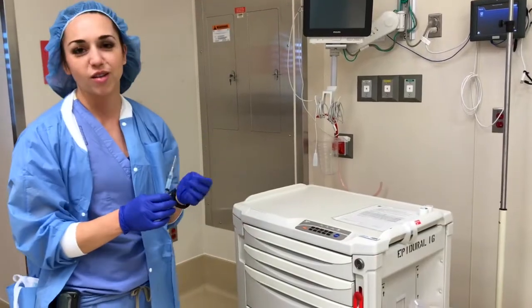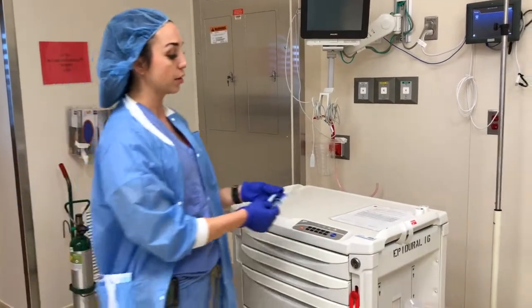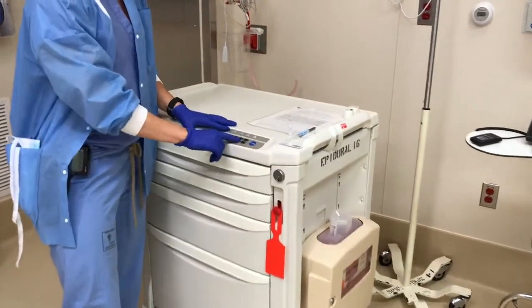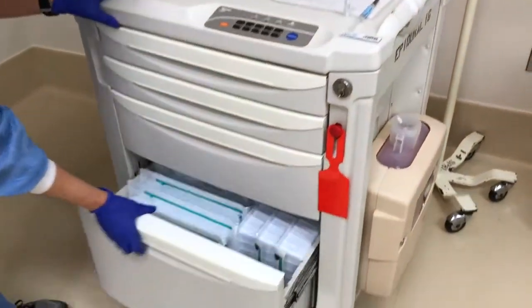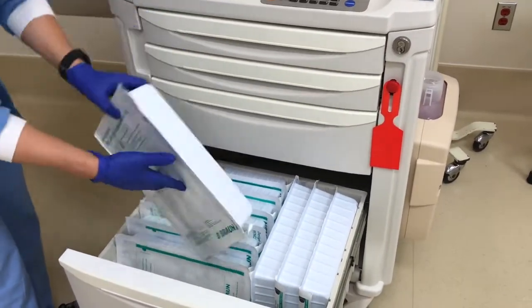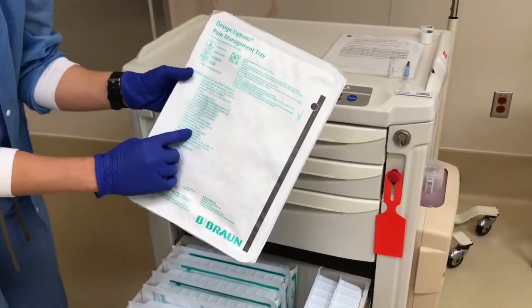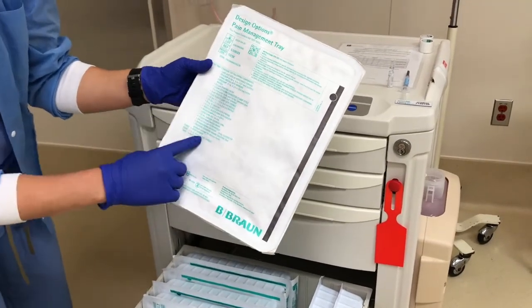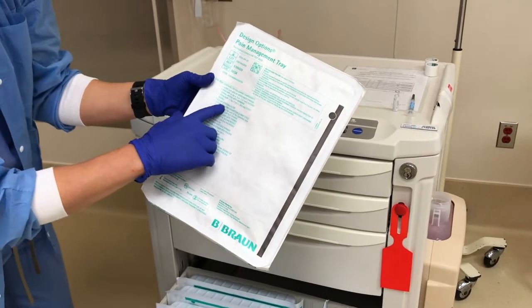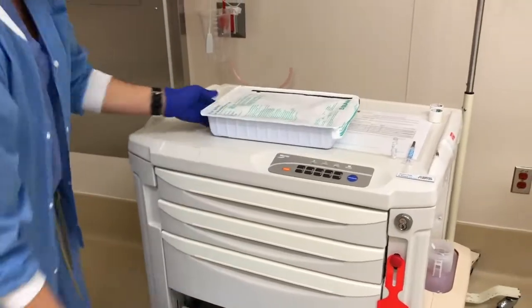All right, so now we're going to talk about setting up our tray for the combined spinal epidural, which is what you'll mostly be doing with the C-sections. Our other anesthesia cart, the code is 0911. At the bottom are all of our trays. So you have a spinal tray, and then if it just says pain management tray, it's both a spinal and epidural tray. If you get confused and forget which one's the combined, you can see that it has both a spinal needle and epidural components in it. So this will be your combined tray that we will get out.